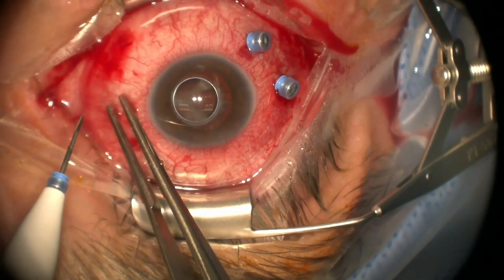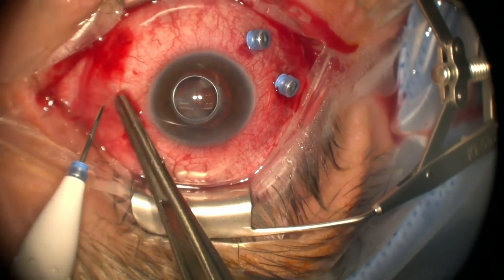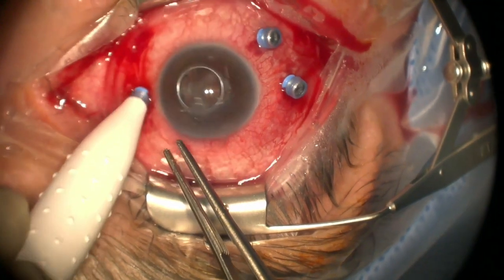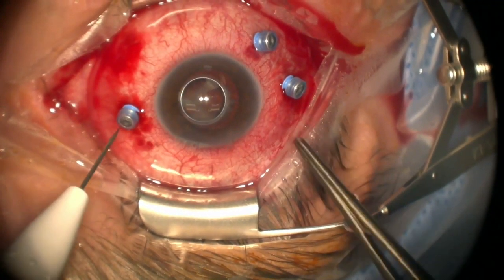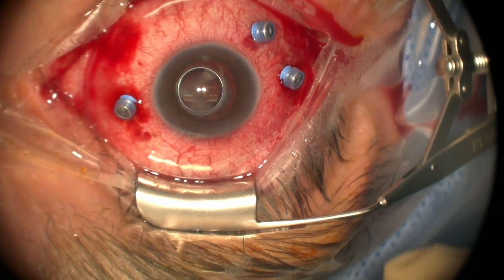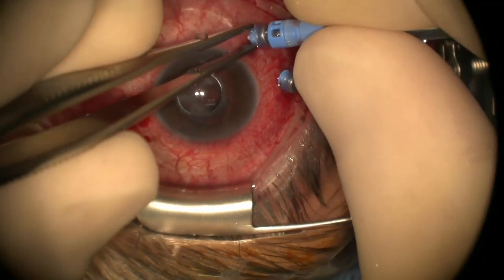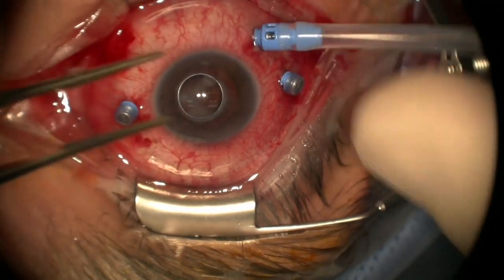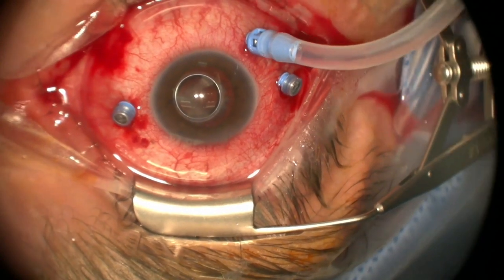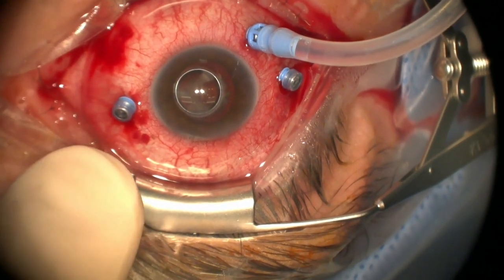This is, of course, one of the problems in using sutures in prior cases. You can see how the conjunctiva just scars down and really gives you some fits if you have to get through it or move it. So I'm almost at the horizontals. There's no trouble or fear about hitting arteries, veins, nerves there. I've never had that be a problem. I know that's where there's some anatomy people are concerned about. And if I ever get a case report or actually see one where someone injured that with sclerotomies, I'd be very interested. So we're going to take the oil out first.